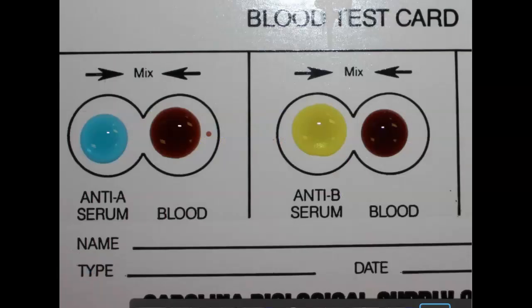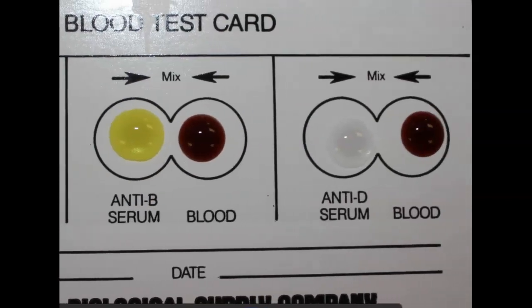So to do blood typing in a doctor's office, what you would do is take a drop of your blood, there and there, and you actually do 3 drops. I can't make the window bigger. So there.